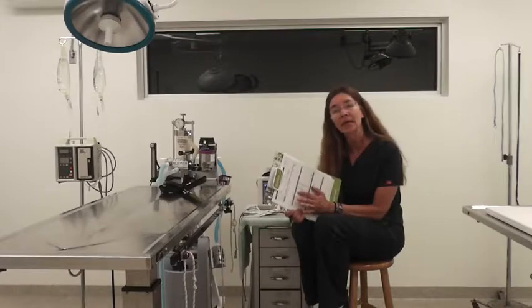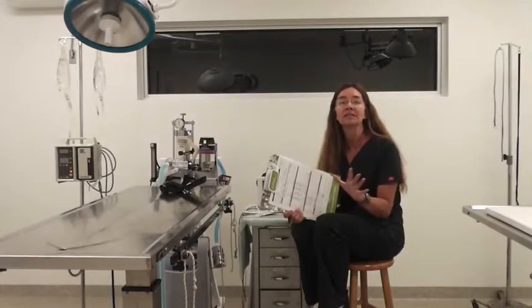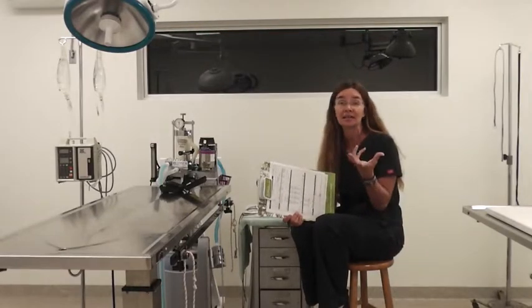We're looking at the heart rate, the heart rhythm, the respiration rate, the respiration rhythm, temperature, the capillary refill time, the mucous membrane color, temperature, blood pressure. All of these things can tell us how a patient is doing under anesthesia and if everything is functioning as it should when they're under anesthesia.